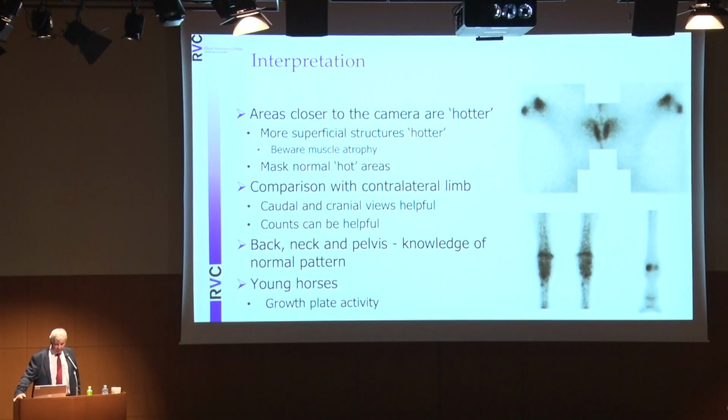The back and the neck and pelvis, there is only one each of these, so the knowledge of the normal pattern is important.